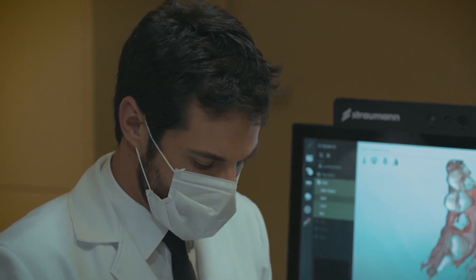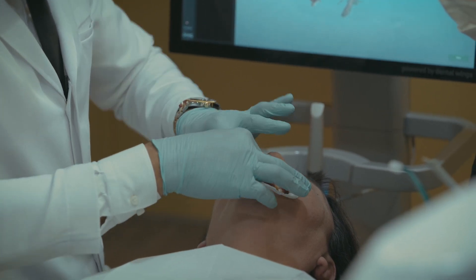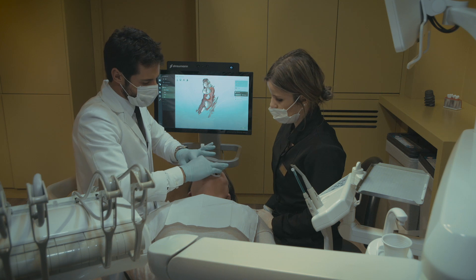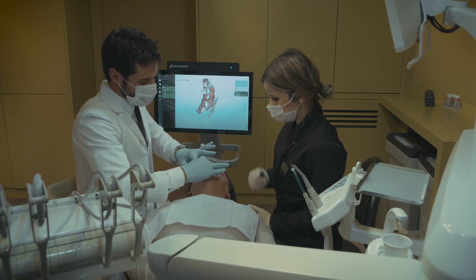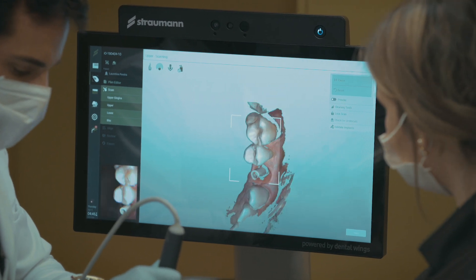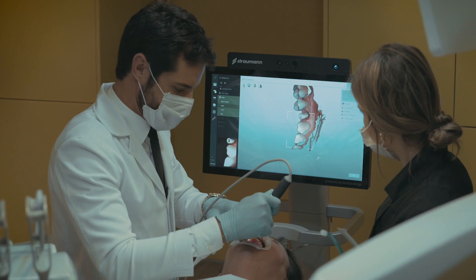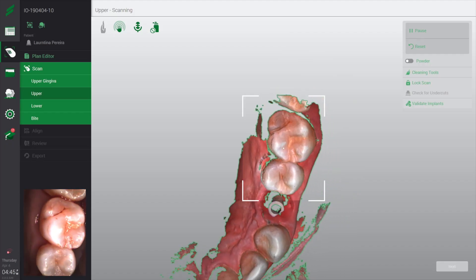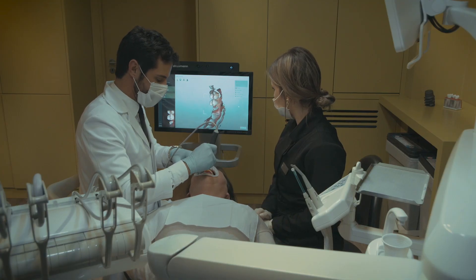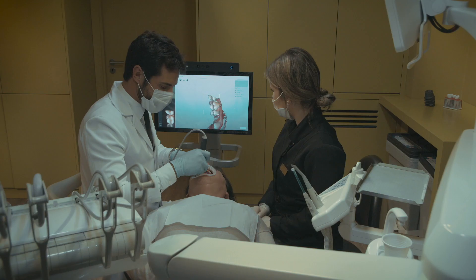Now we will put our scan body in position — the scan body is for our implant, for our narrow platform implant, VLT. We always try to put the flat platform to buccal, to merge the virtual scan body. In this part you detect the scan body and do the full arch scan — in this case we will do a half arch scan. As you can see, the scan body is very clearly visible. The definition of the image is very clear, and because the handpiece is easy to manage, it's very small and comfortable for the patient.